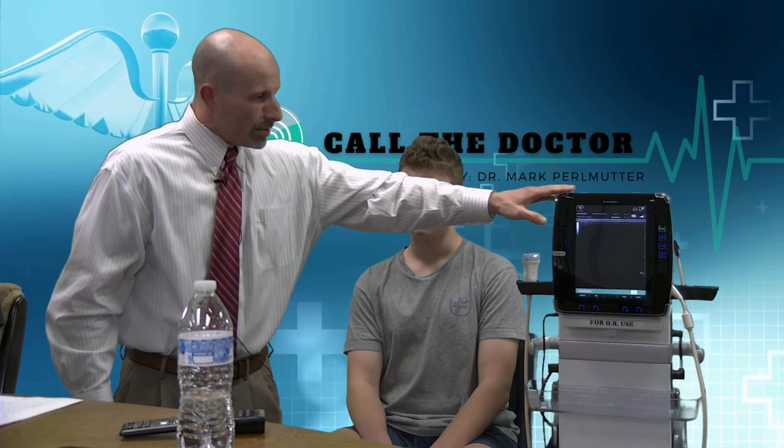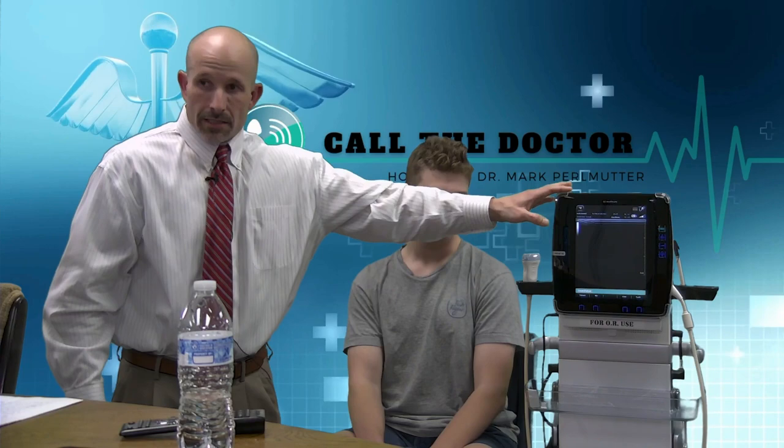To keep you the safest possible — you just can't get safer or more effective anywhere — because of the high-tech investment the hospital has made and people like Dr. Hobgood they've hired. So I'm going to demonstrate what's called a supraclavicular nerve block, which is the most common nerve block I and my colleagues do for upper extremity and arm surgery — the elbow and hand surgery that Dr. Perlmutter does. This is an ultrasound machine we use to visualize the anatomy and structures where we'll be placing the numbing medicine.